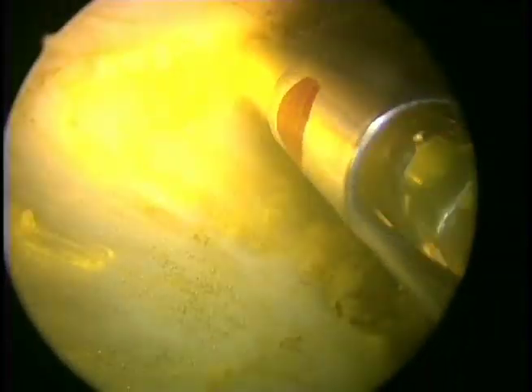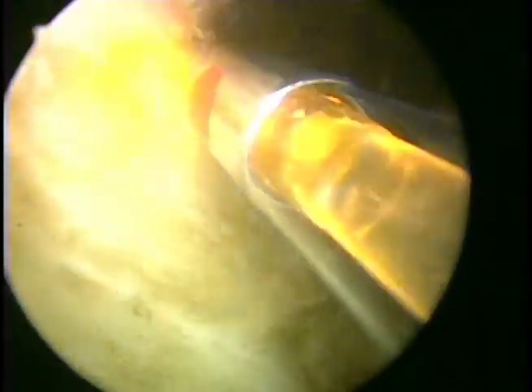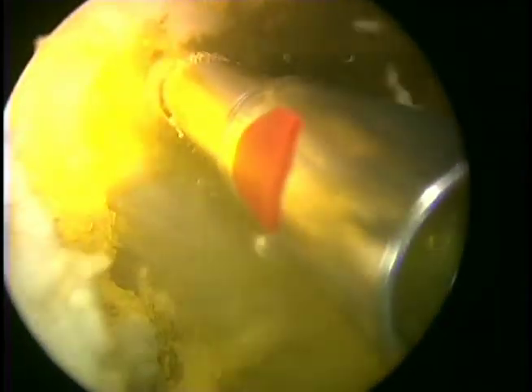Once this plane of cleavage has been created, it's quite nice to simply follow along that natural white groove plane. In this case, we're going to head a little bit undermining the right lateral lobe and debulking that tissue. You can appreciate that at some points we drag the fiber along that point of cleavage. In this instance, we're going to simply rotate in a 30 degree manner, with a very slow sweep speed, to vaporize and remove tissue.